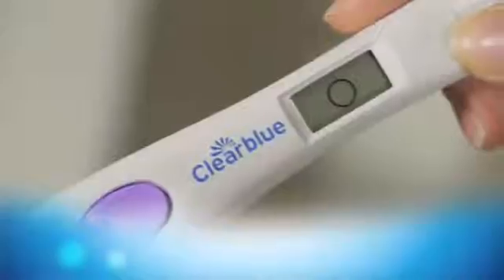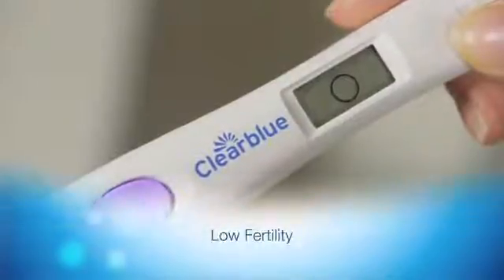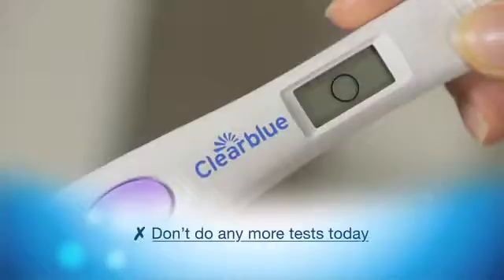Your result will be displayed within five minutes. If the test shows low fertility, indicated by a blank circle, you're unlikely to get pregnant if you have sex today. Don't do any more tests today.